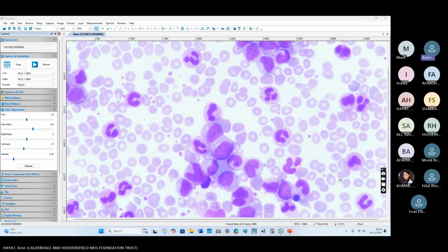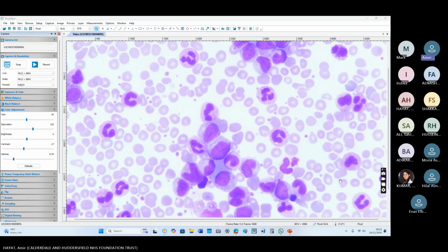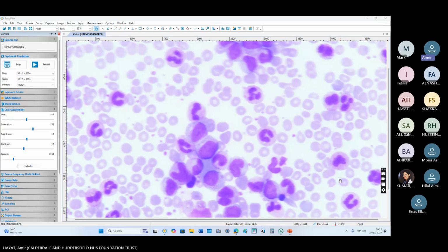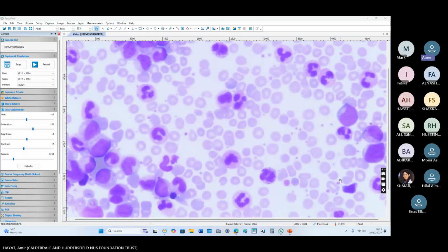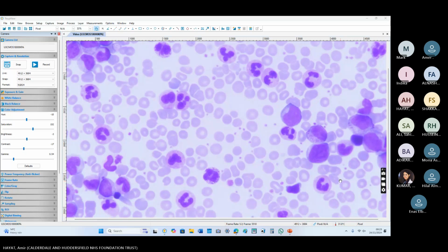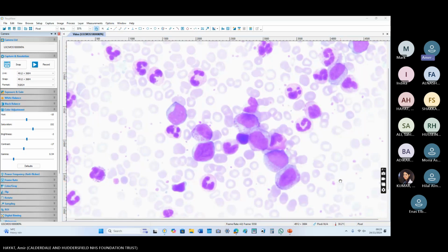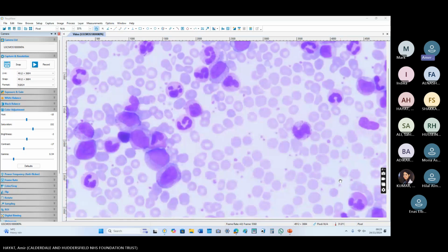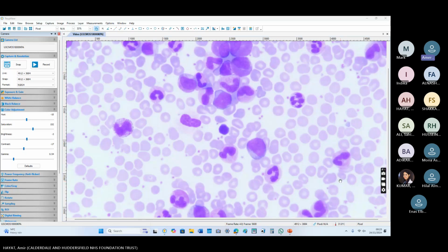There is eosinophilia, basophilia, and the whole myeloid spectrum, which you didn't see in the septic picture of blood film. The basophil is the main differentiating point between leukemoid reaction and CML.